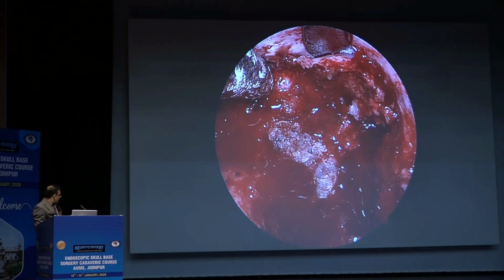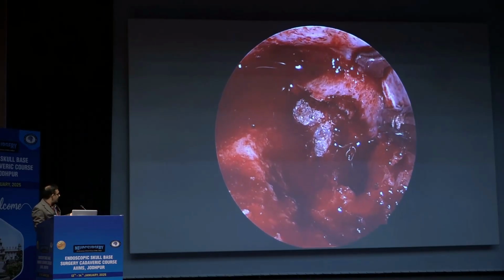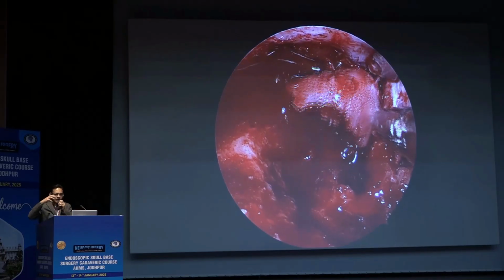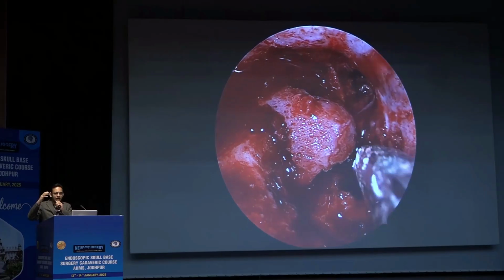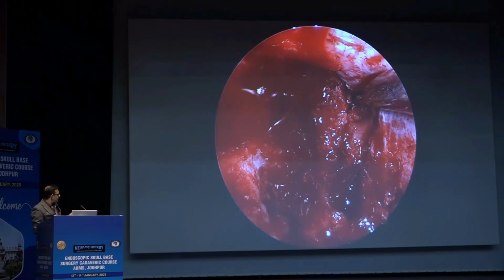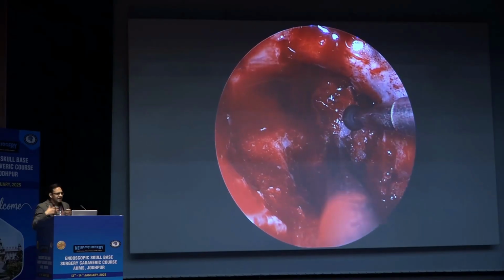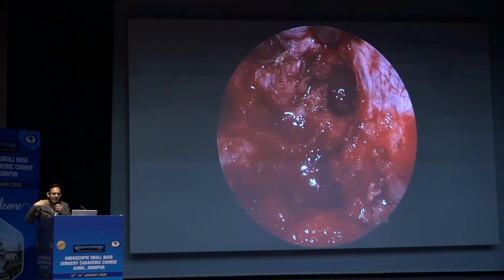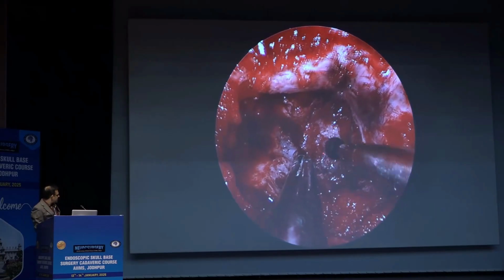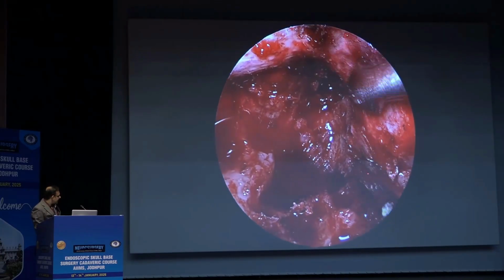So at this point of time, we've now done the initial exposure that I tried to show you earlier. I'm now detaching the posterior clinoid, and here the outer periosteum of the bone forms a nice margin for resection. So the first bit of tumor has been resected. This is a very young male patient, so there's a very interesting anatomy where you can see the cartilage and the fibrous fissures also. So now we are drilling towards the petrous apex inferiorly. The entire ICA has been exposed.